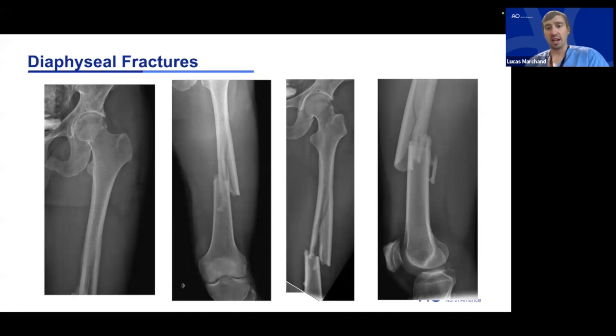That was great. And it has been highlighted, but I will additionally reiterate that evaluating the joint above and below long bone injuries is very commonplace, and something that we typically do with dedicated radiographs in an effort to hone in and get good images of the knee, or in this case, of the knee and the hip. Because just getting the diaphyseal or long bone femur films doesn't allow us to hone in on the granular detail of the joint segments above and below the injury.